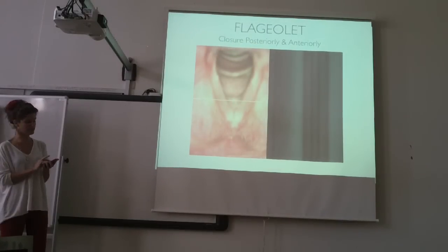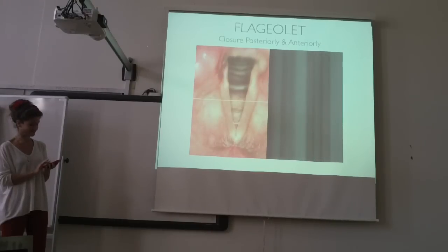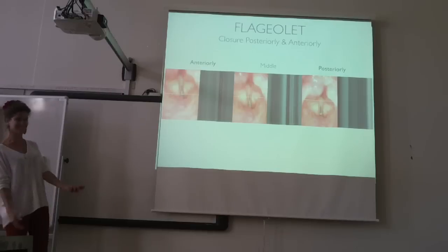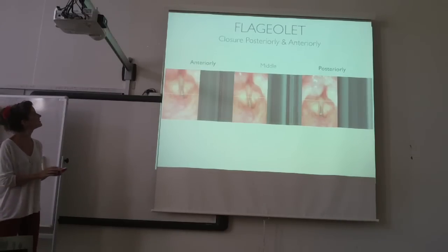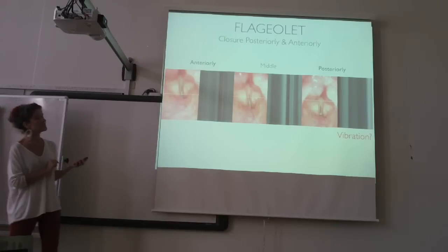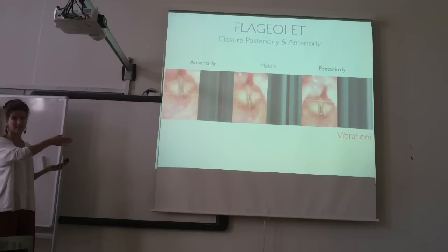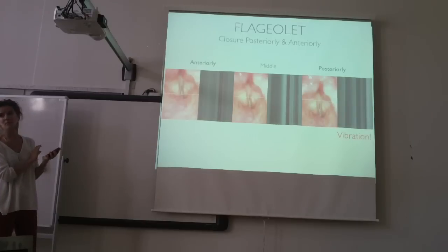Posteriorly and anteriorly, not in the middle. Mind you, this person was doing it well. Very elegant. So they don't close in the middle, but they do close anteriorly and posteriorly. This next one is a flageolet. Oh, no, yeah, I went too fast. I have to go back to this one. So here we didn't see vibration, but when we put the scanning line a bit lower in the image, which means more anteriorly, we did see vibration.